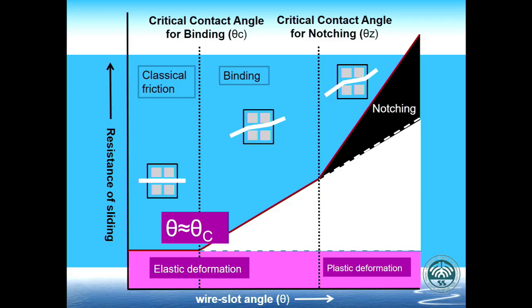When we look at the situation in the first order direction, this is second order, and this is first order. You will find that for efficient tooth movement, you also need a small theta angulation, just a little bit larger than theta c. At this time, the archwire will just start elastic deformation and the friction is not very high. That's good for tooth movement.